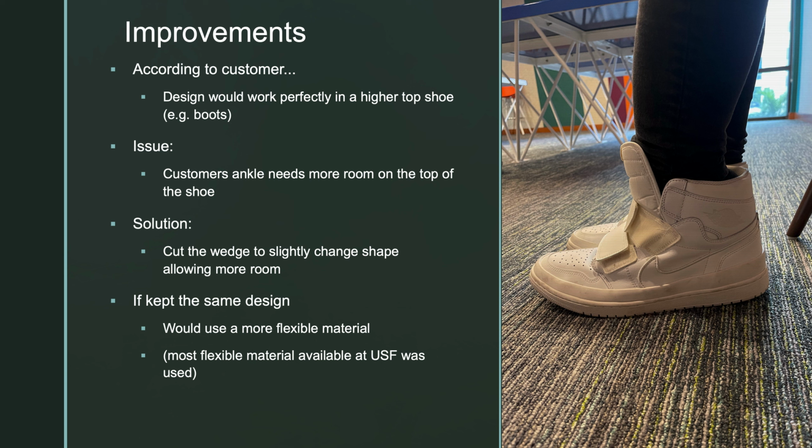And if we were to keep the same exact design without changing any shape, we would find a more flexible material than what we used, even though we did use the most flexible material available at USF. But next time we would go somewhere else to 3D print to find something else. And now Turki will cover our final thoughts on this project.